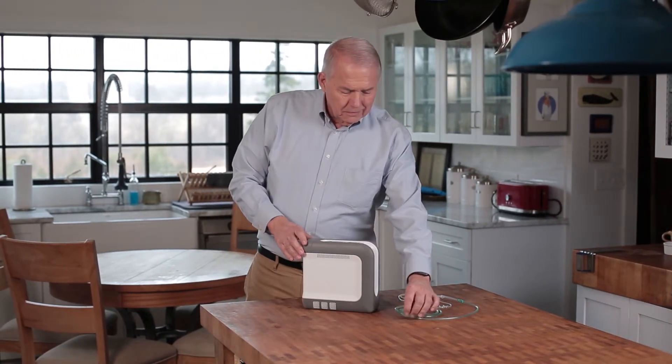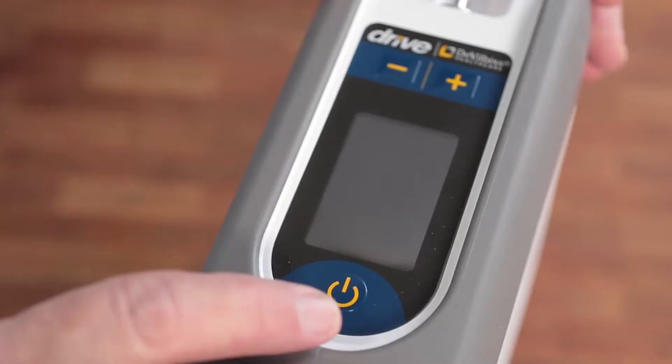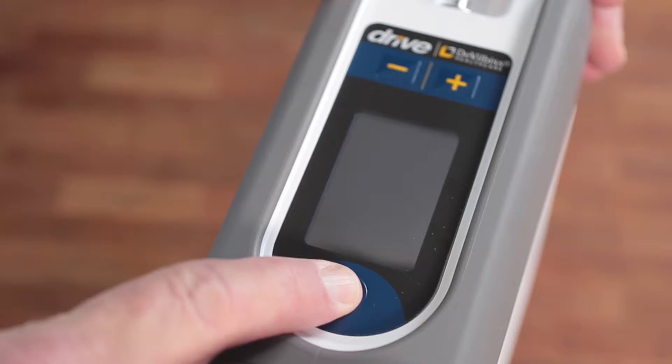Connect the tubing to the oxygen outlet and cannula. To start your iGO2, press and hold the power button to turn it on until you hear a beep.